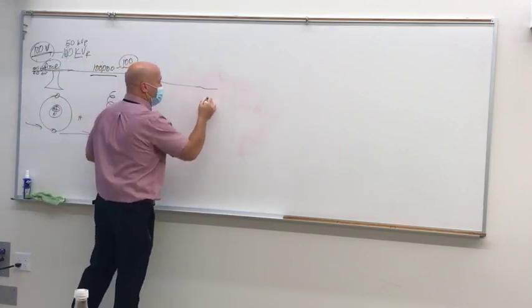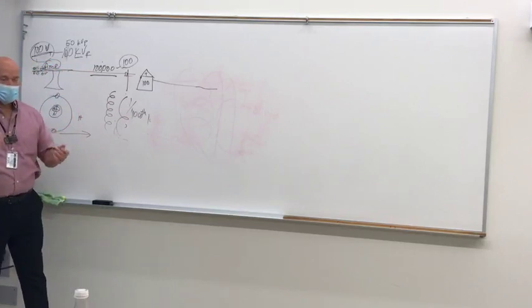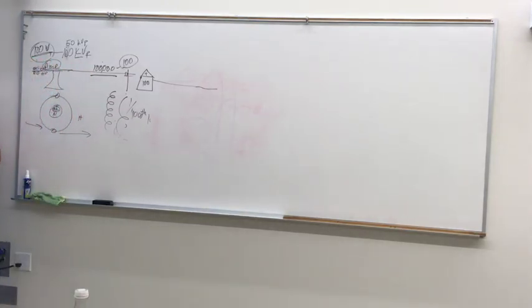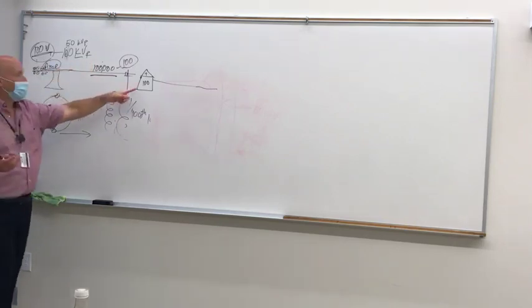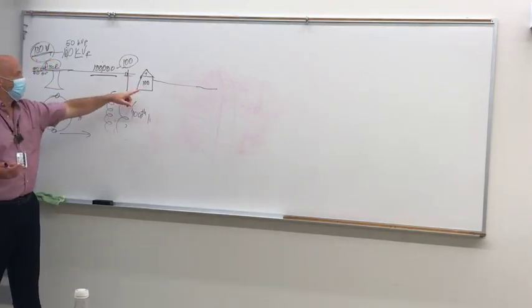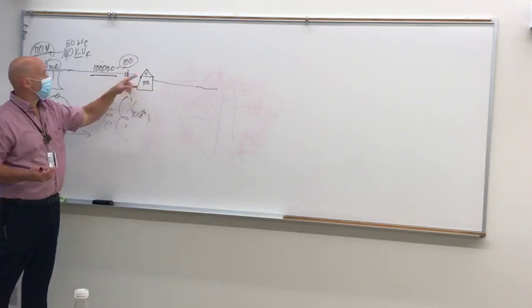So it goes into the X-ray imaging system, but what kind of voltage do we need? 50 to 100 kVp. Bingo, and kVp is kilovoltage. What do we have here? 100,000, which is 100 kVp. Right, so now we've got to take this thing that they did for us, or did to us, depending on your perspective, and we've got to reverse it.